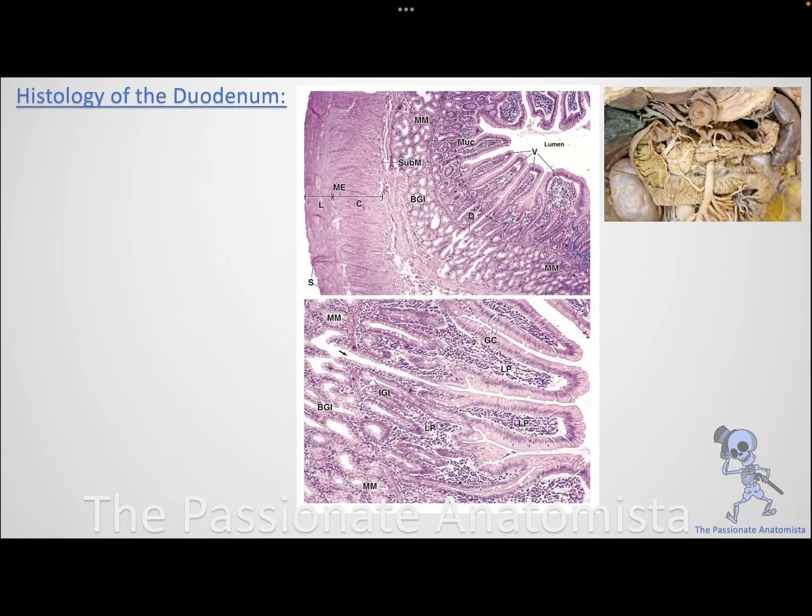Okay, now this is another nice picture. Remember when I told you in the previous video I wasn't quite happy with the gastroduodenal junction? Here, if you see this, this is a perfect picture for the villi. If you see this and see the stomach in the other part of the picture, that is the gastroduodenal junction. And sorry, pyloroduodenal, we call it. It's okay, or even gastro is fine. The pyloroduodenal junction, but that would be a great picture to ask you about the pyloroduodenal junction.